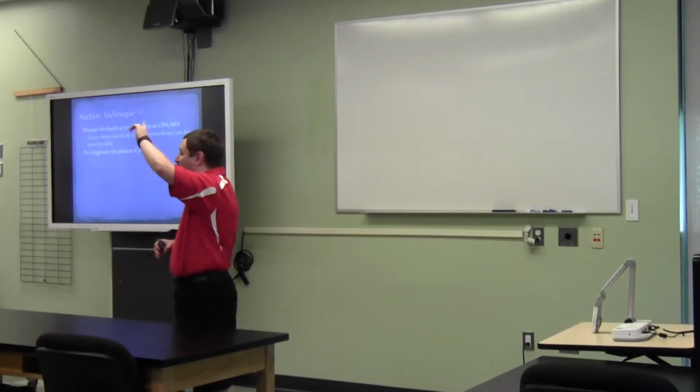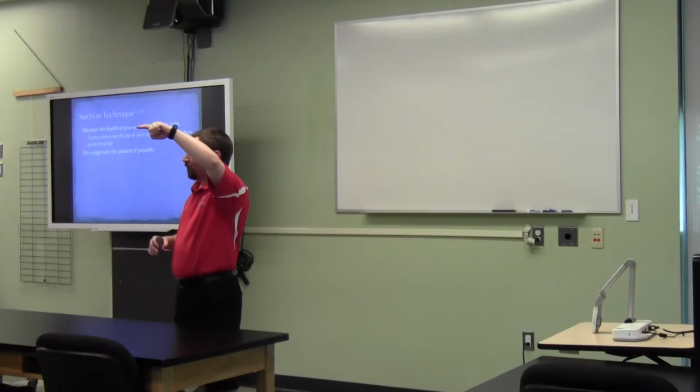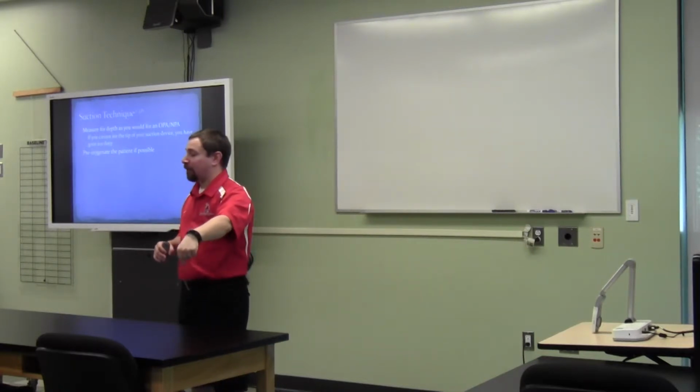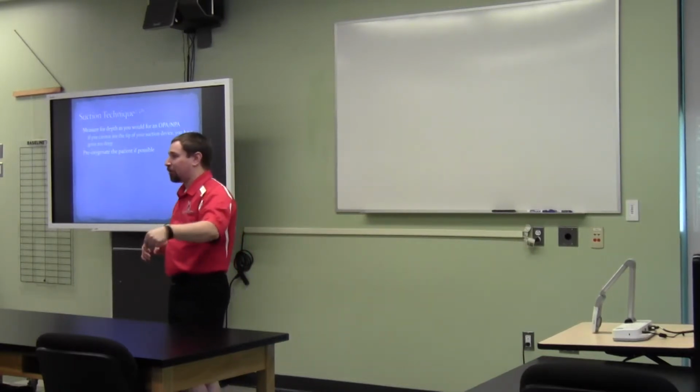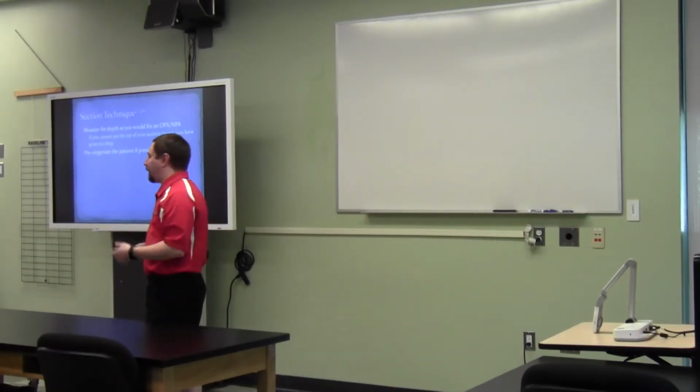Okay, so we'll come back to that bell curve so that I keep them well above it, and I've got some room to work so they don't get close down to 90, and then the bottom drops out. Now I'm going to be behind the eight ball. Okay, that's kind of that logic to top them off, and go from there.